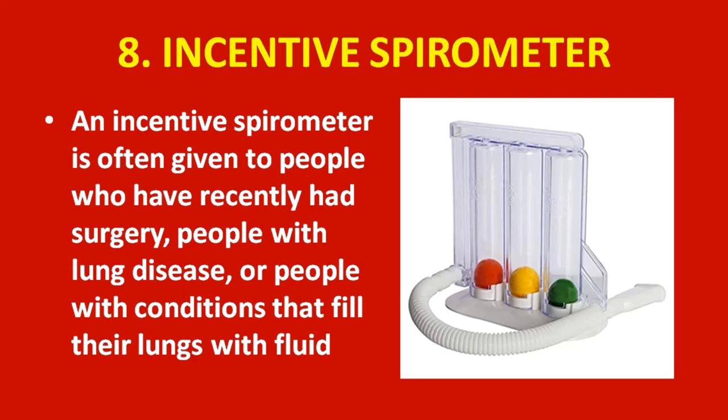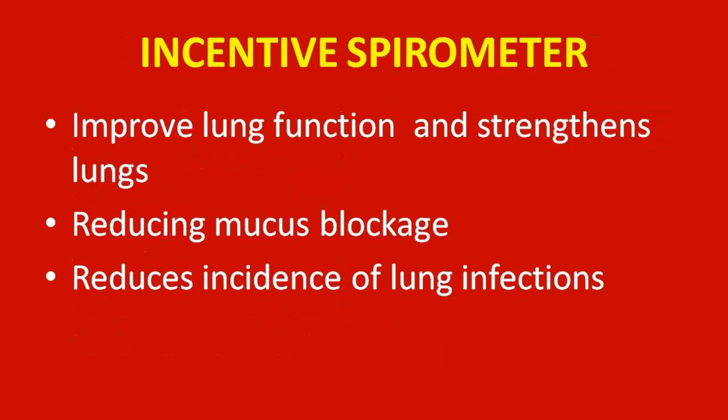This slide shows incentive spirometer. An incentive spirometer is often given to people who have recently had surgery, people with lung disease, or people with conditions that fill their lungs with fluid. Incentive spirometer improves lung function and strengthens the lung, reduces mucus blockage, reduces the incidence of lung infections.